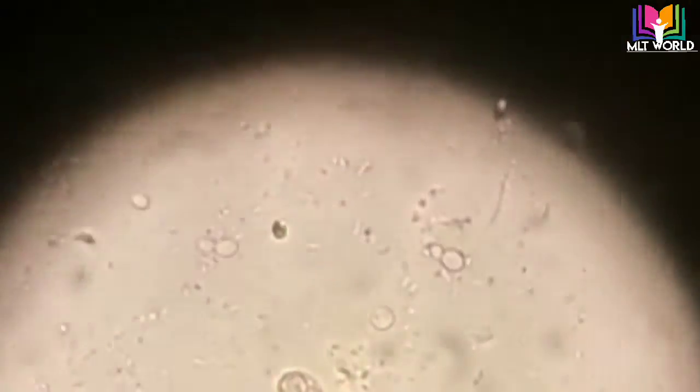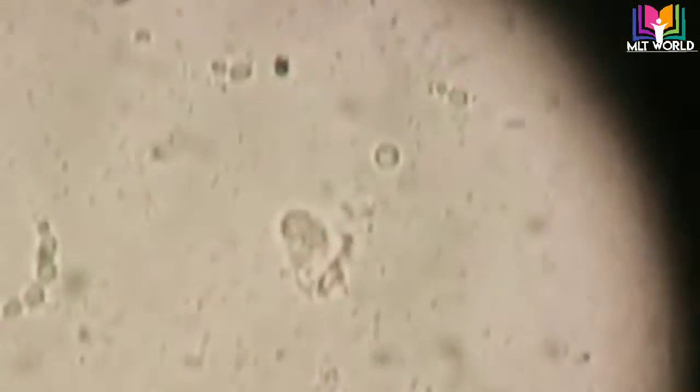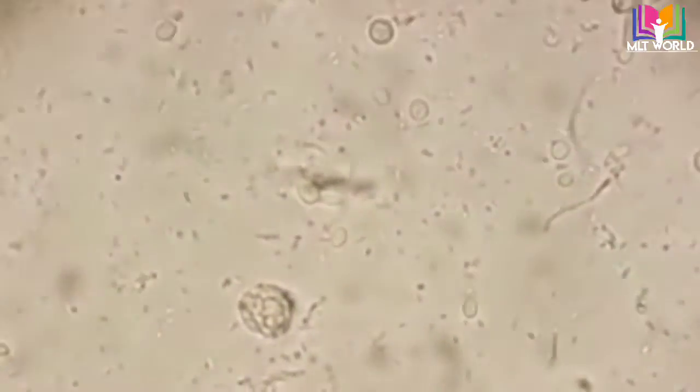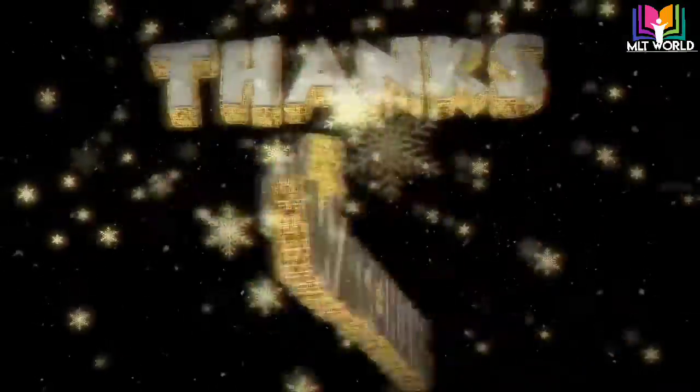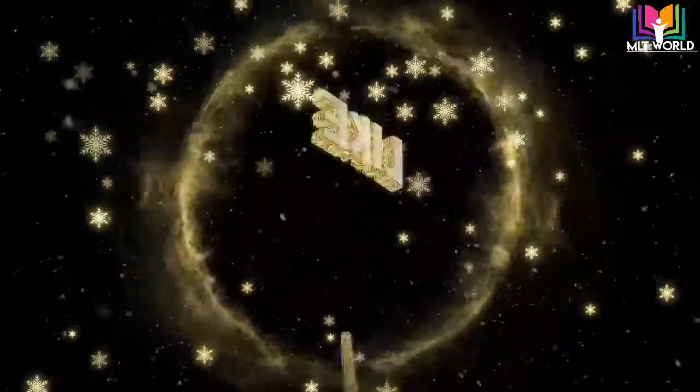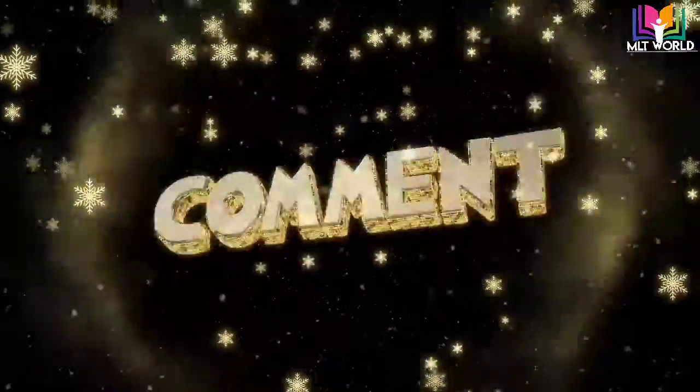Yeast cell infection is more common in females than males. Other than that, you can also observe yeast infection in diabetic patients, but it's treatable, it's not a big deal. I hope now you understand and you can easily identify yeast cells in your urine microscopies.